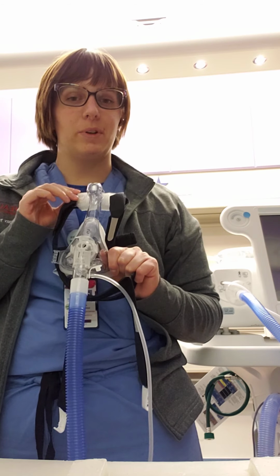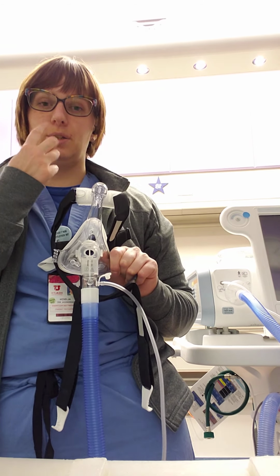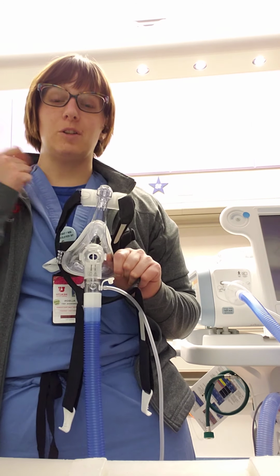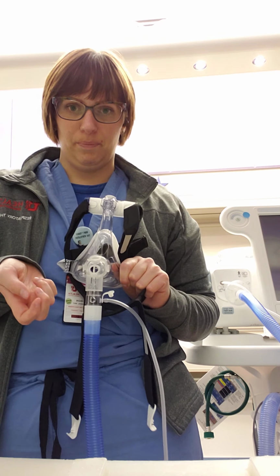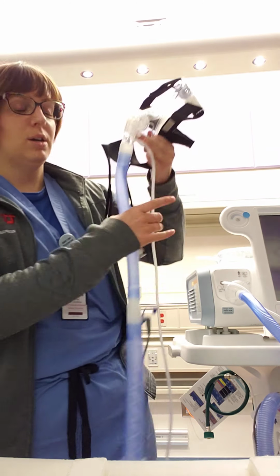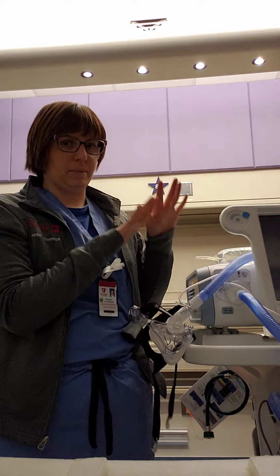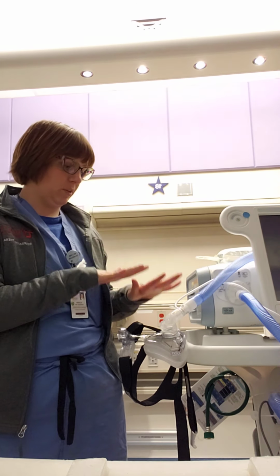It may also be referred to as a scuba mask, because the nasal mask and the nasal prongs will cause too much of a leak to support ventilation. But those can be used for sleep apnea situations. Very appropriate for those. So I have my circuit, my mask, everything ready to go.